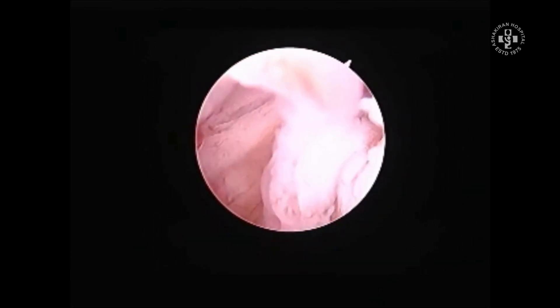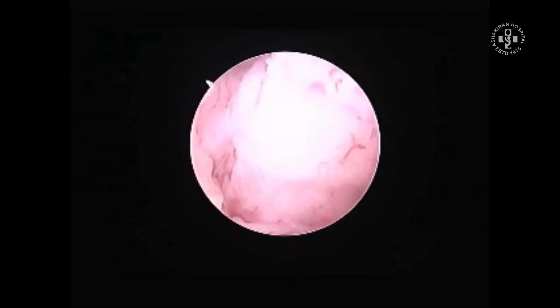You can tell the patient that the tubes are patent, but the patient may not be achieving pregnancy and may require further treatment. These are better tools to show the patient the specific problems being encountered. You can see the architecture of the fimbria — the inner mucosal folds as well as the blood vasculature. Going inside from here is called falloposcopy, which will tell you about the inner lining of the fallopian tube and the functionality of the mucosal fold pattern.